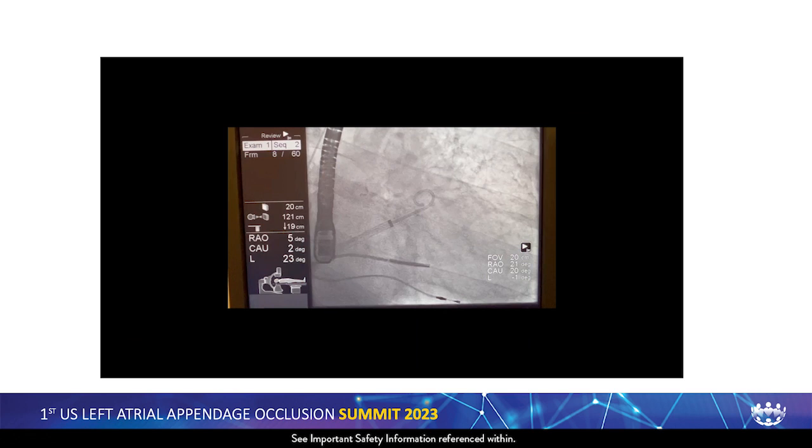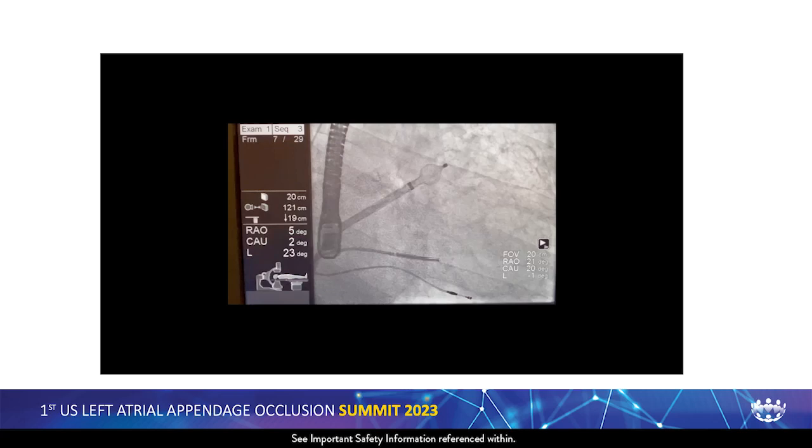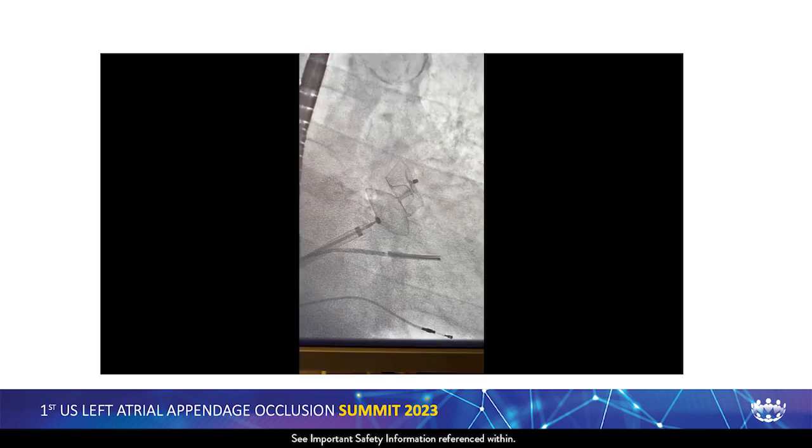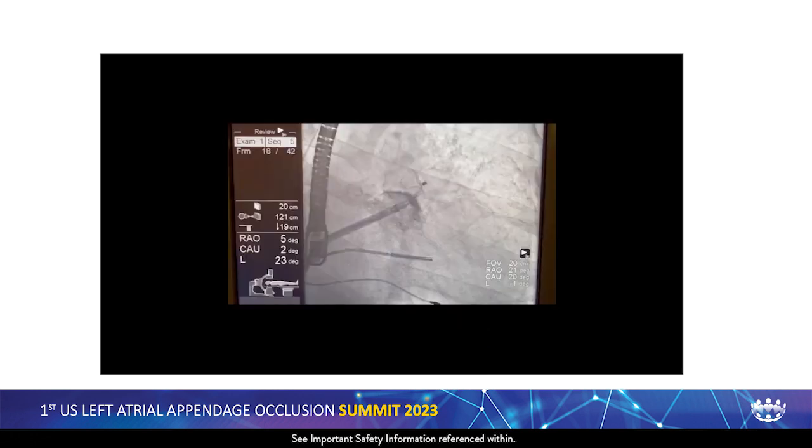These are the fluoroscopic pictures, just to correlate you with the same case. This is the ball-shaped angiogram that you can see. Of course, we minimize the use of contrast in this case because of the potential clot. This is the device orientation. This is the final tug test, as you can see. And this is the eventual result. There's no contrast going in or out of this, and the device looked quite stable.